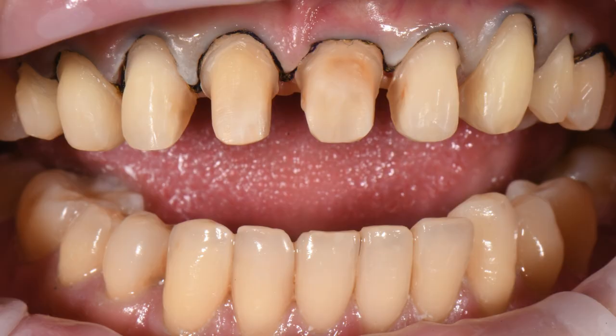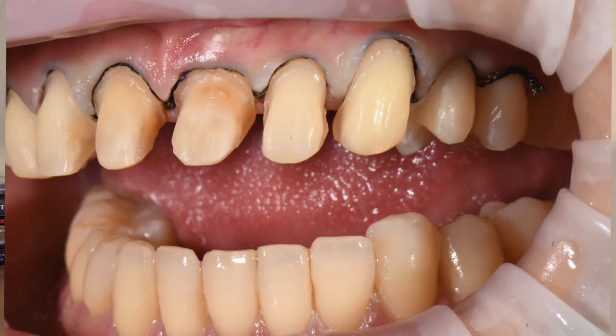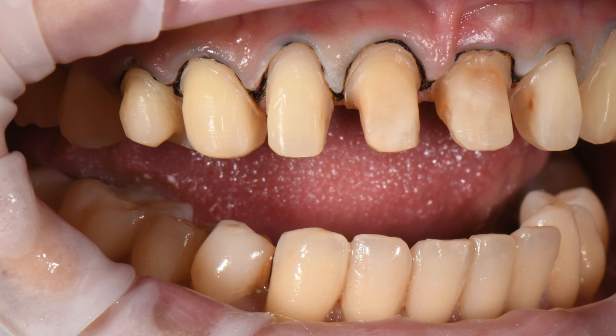So when I opened the teeth, I noticed that there are big cavities on the two front teeth. Super tagal na niya, ang daming recurrent caries, ang dami ko natanggal. So the preparation is kinda heavy on the two front teeth. But the rest of the teeth are minimally invasive. I just removed yung facial area, and also may mga extension din for some parts because we have to make sure that all unsound structure must be removed.